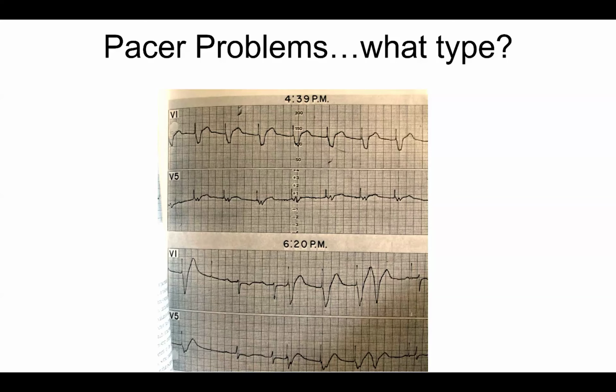A lot of surgeons just won't do it. And I think it really depends on what they're doing. If it's a type of surgery where you need to Bovie for like 30 seconds in total for the whole case, I would argue it's much safer to just leave the pacemaker on. And what we'll often do is suggest putting the ground pad far from the surgical field and from the pacemaker pocket, and then to use the Bovie sparingly. Don't do 30 seconds of Bovie. Do 5 or 10 seconds, give the patient a break, and then proceed again.